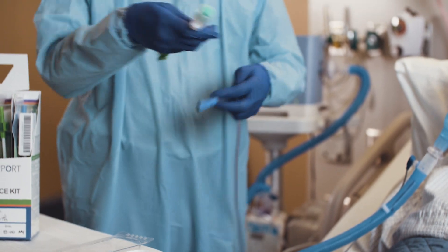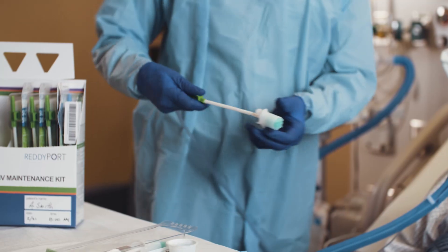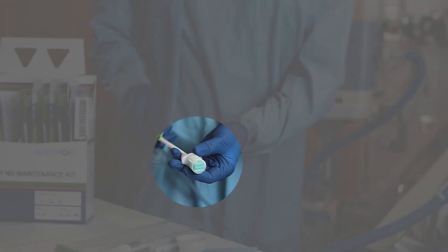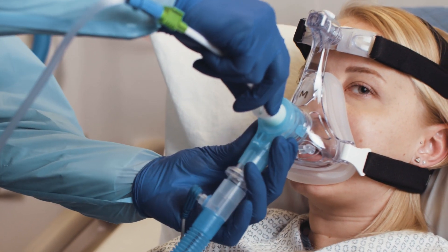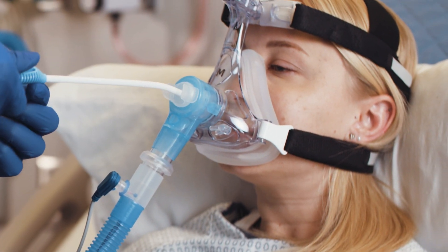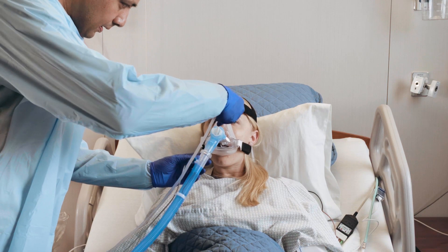To use the suction swab or toothbrush, connect the oral care appliance to the suction tubing. Moisten the sponge or brush by retracting the protective guard and dipping them into the appropriate oral solution. Retract the moistened tip into the protective guard to cover it. While stabilizing the mask with one hand, push the protective guard into the ReadyPort elbow with the thumb and forefinger of your other hand. Gently advance the appliance into the mouth and perform oral cleaning. Suction excess fluid by placing a finger over the suction port.